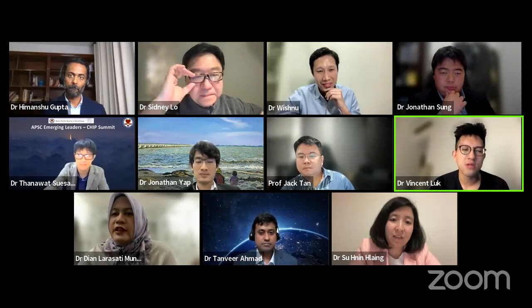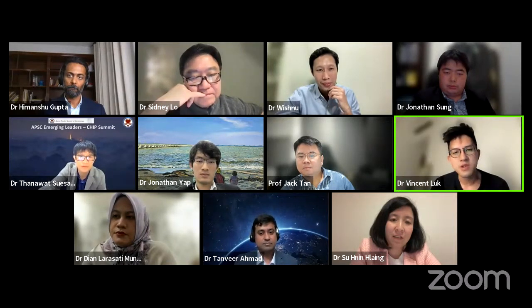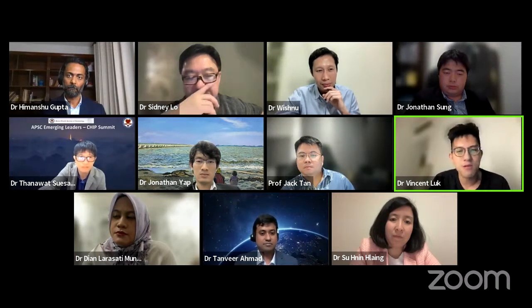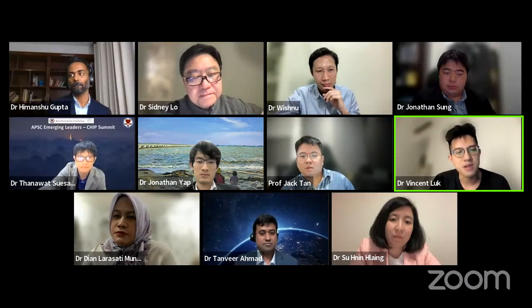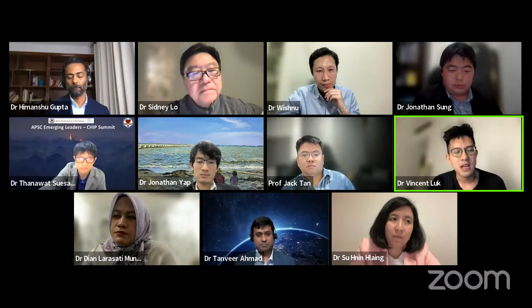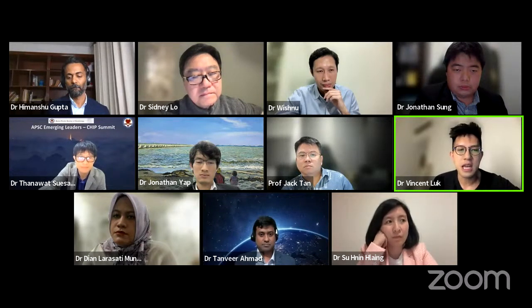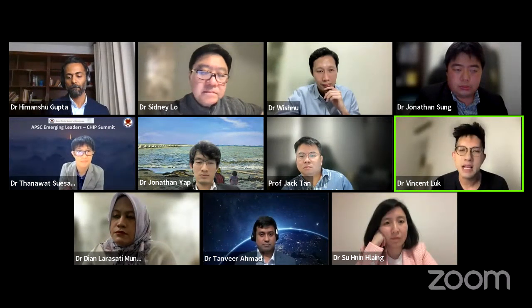Yeah, I do agree that in those circumstances orbital atherectomy probably works better, because with the rotablator, it's sometimes determined by the wire bias, and many times that's not something you can control. Of course, you can play around with the wire and the guiding direction, but you can't always get what you want. On the other hand, orbital atherectomy does help a little bit, and I agree that I have less balloon rupture after orbital atherectomy.